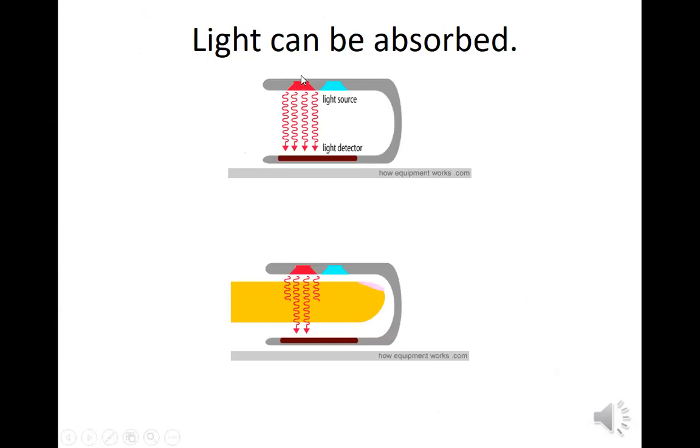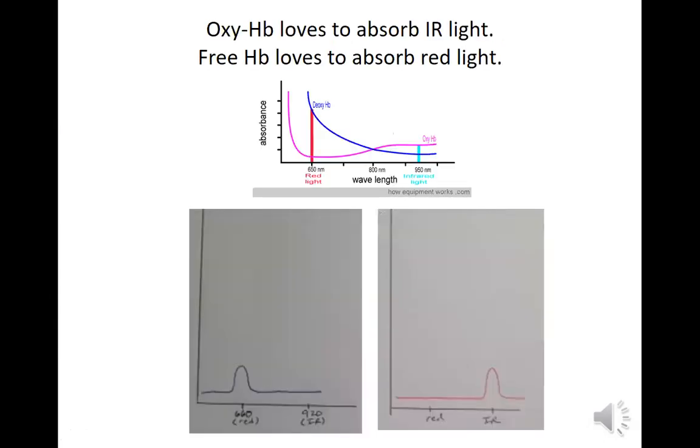And here's how it works. Basically, the light will go from the top to bottom, and the arterial blood will absorb at two different wavelengths, at 920 and 660. And whatever doesn't reach the sensor is being absorbed by the blood. So hopefully you have a 95 or greater % of infrared light being absorbed at 920 than you do at 660 of that total hemoglobin sample.